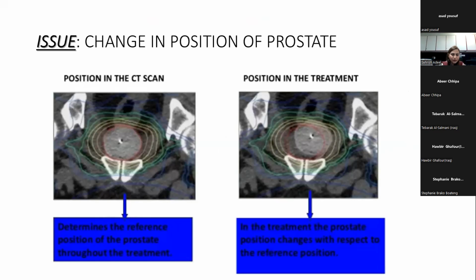There must be studies like that, but I haven't read any such study on the basis of which I can tell you what exact difference we can see in prostate cancer patients in different directions. But my observation is that the impact of the rectum filling is more on the prostate as compared to the bladder filling.